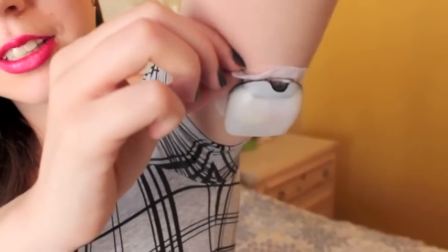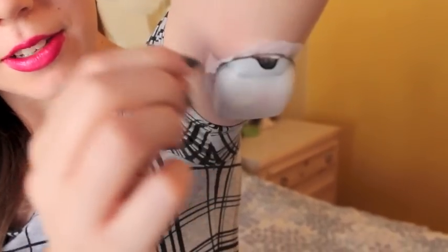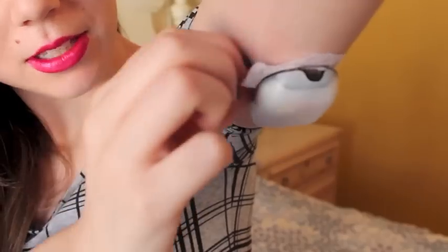You just take a little bit and you start applying it around the edges. One thing that I found when it comes to taking an Omnipod off is if you can find the weak spot, once you pull on that weak spot, the rest of it comes off pretty easily. Alright, so I think I found the spot that'll get the rest of it off.